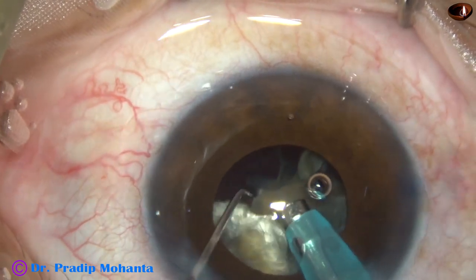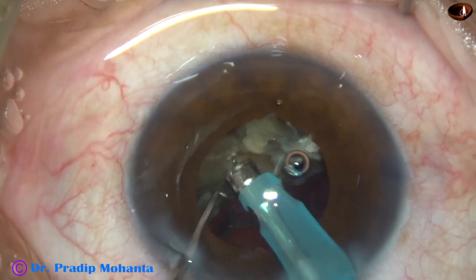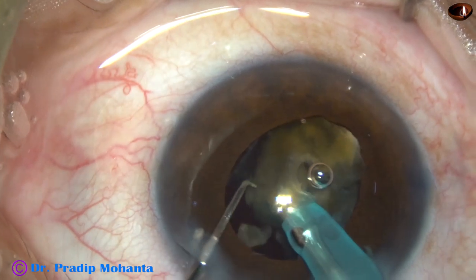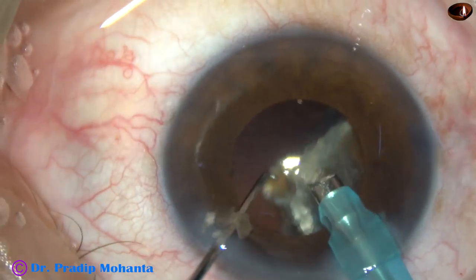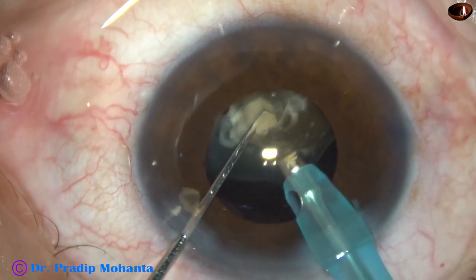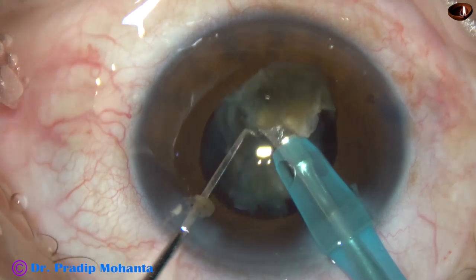The microscope is OMS 800 from Topcon. Now the other two pieces — the other hemi-nucleus — are tilted again and the apex is approached and attacked first. Slowly, taking care of anterior chamber stability, the pieces are emulsified. This is the last piece, and we must be extremely careful during emulsification of the last piece. Most PC rents occur at this stage, during emulsification of the last piece. It has been subdivided. The tip is never fully occluded at this time, and the anterior chamber is nicely formed.